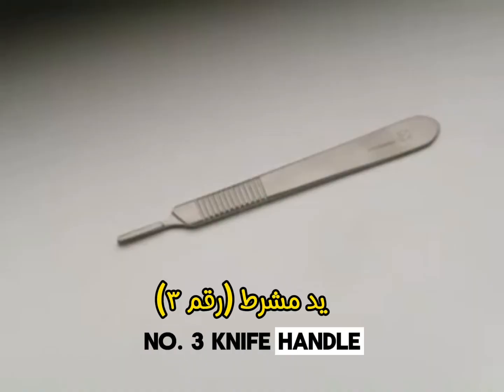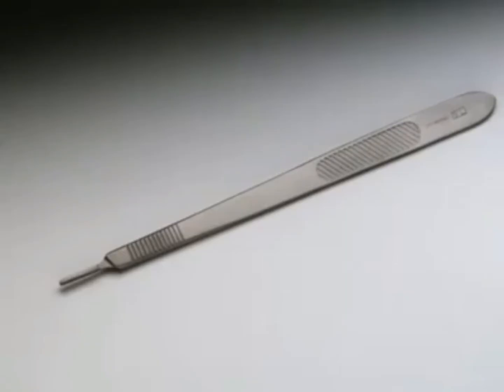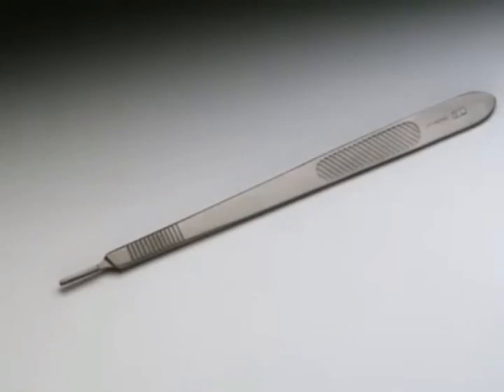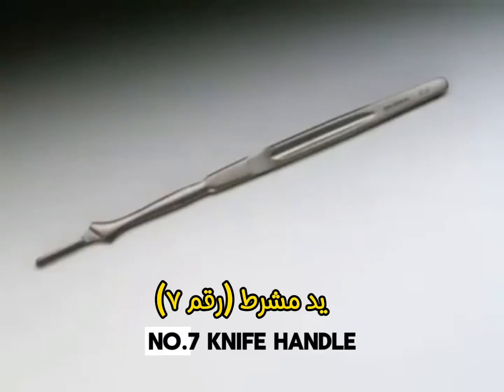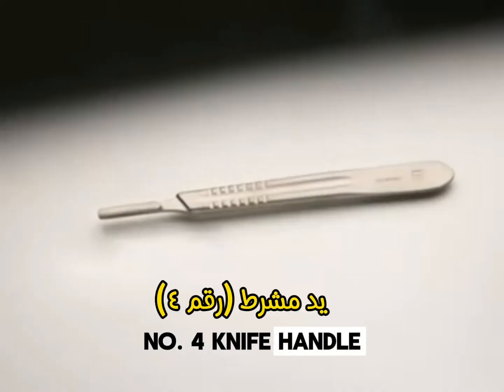Number 3 Knife Handle. Number 3 Long Knife Handle. Number 7 Knife Handle. Number 4 Knife Handle.